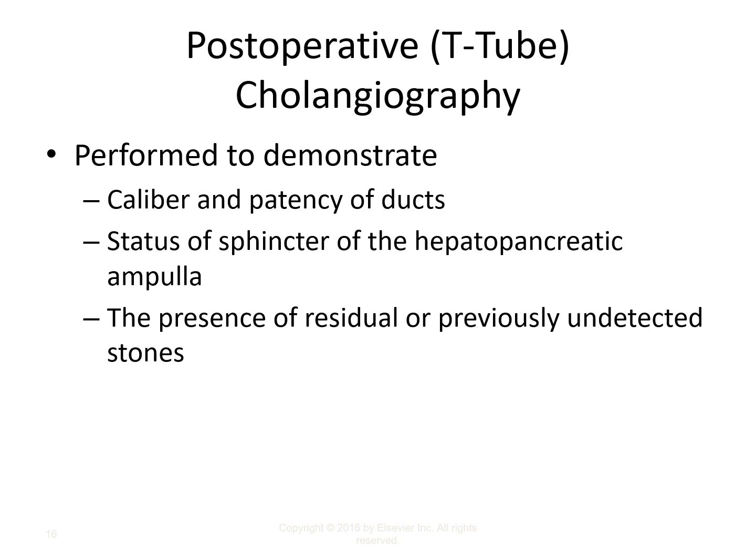So why are we performing a T-tube cholangiogram? Well, first of all, we want to demonstrate that the ducts are patent. That is, that there are no other stenoses or stones present. And if there are residual stones, where they might be located and whether they might be extracted by an ERCP.